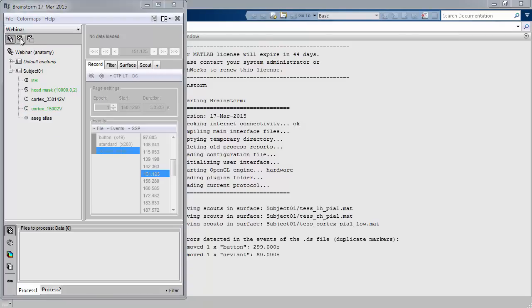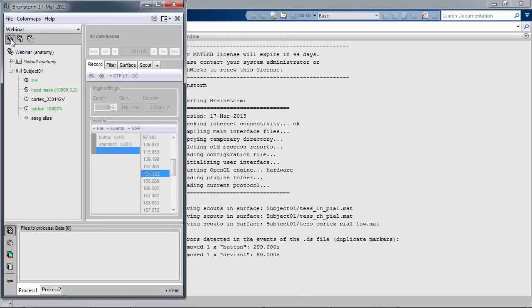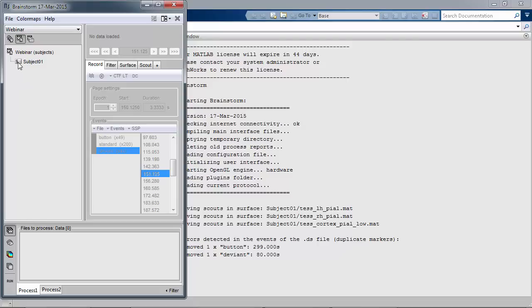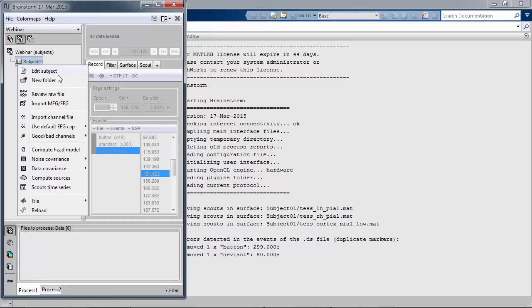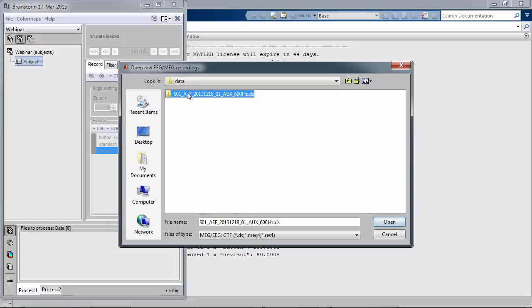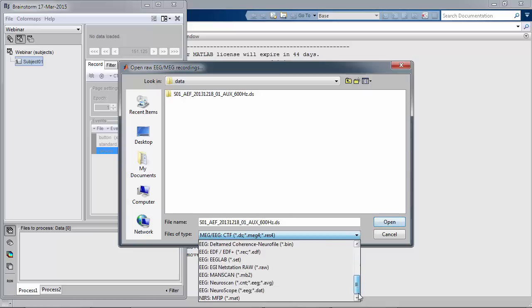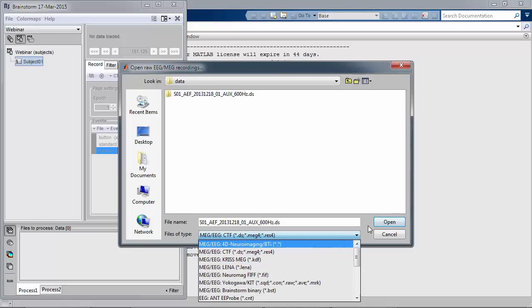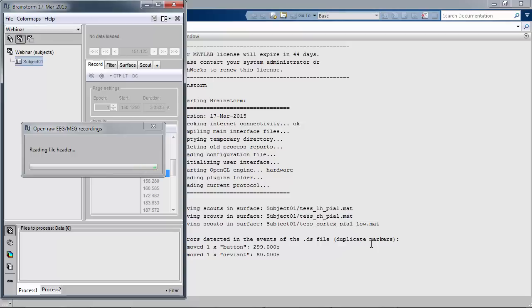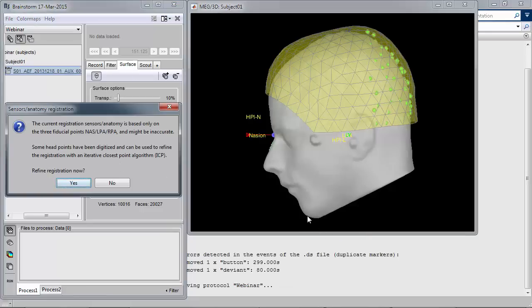Now we're going to switch to the functional aspects of the data. You see this button — it's going to change the display of the database. Here you see all the anatomy-related files. Now I need to populate and import some data from electrophysiology. Today we're going to look at this MEG audio file. We're working with a MEG CTF format data file, but as you can see from the pull-down menu, we can work with Brainstorm with a large selection of EEG and MEG file formats.